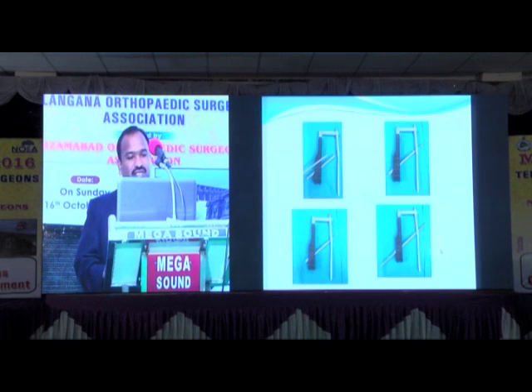Then I will make the incision, put a dent over the trocar, and pass a 4 millimeter guide wire, so that bending of the guide wires during insertion will not occur. While doing reaming, sometimes breaking of the K wires is possible. This complication is prevented by reaming with the 4 millimeter.